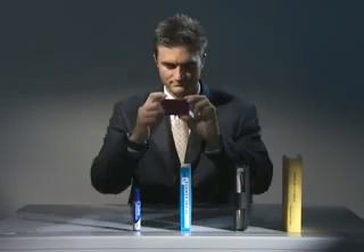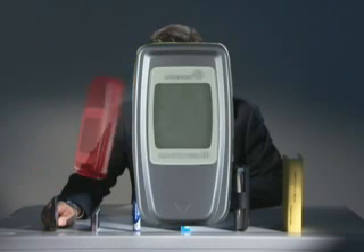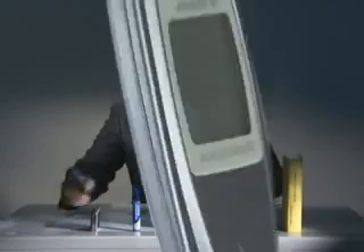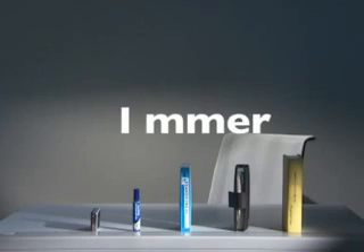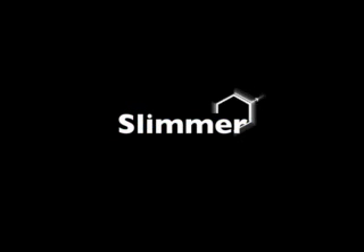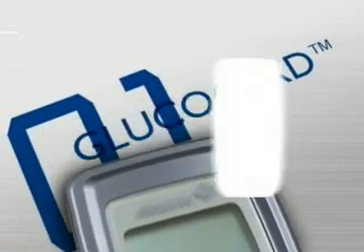Slim — the slimmest of them all. Glucocard 01 is surprisingly compact and remarkably slim and stylish. The ideal design is both stylish and easy to use.